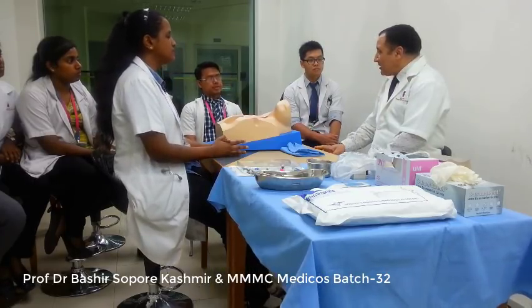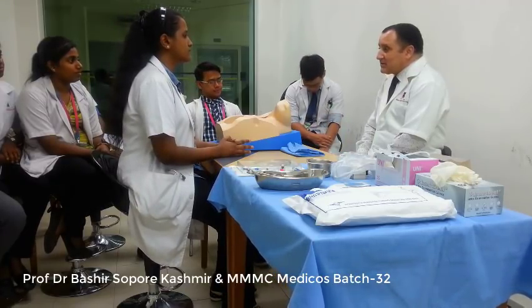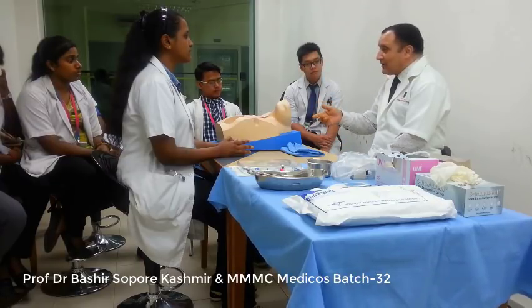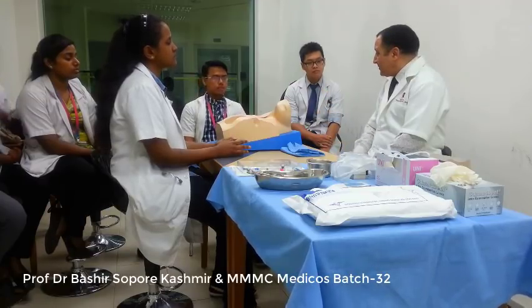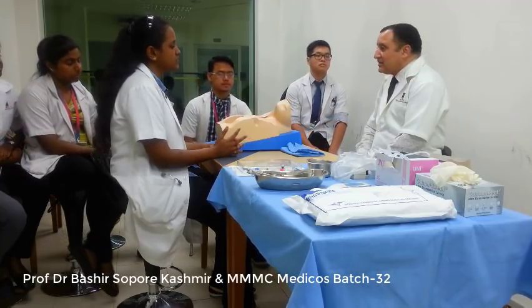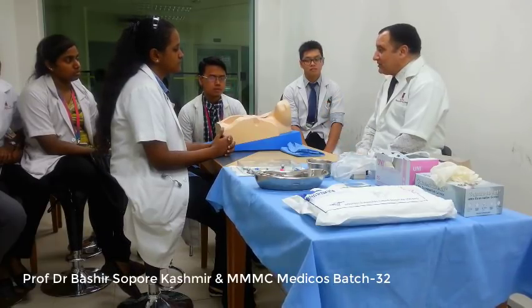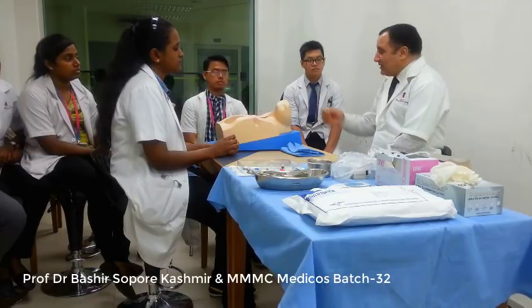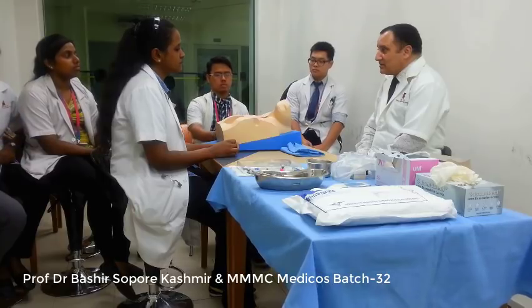The first step is that you go to the patient, and if you find the patient is conscious and alert, you take the permission from the patient that you want to do central venous catheterization on him. Also, you will explain the benefits as well as adverse effects of central venous catheterization to the patient.